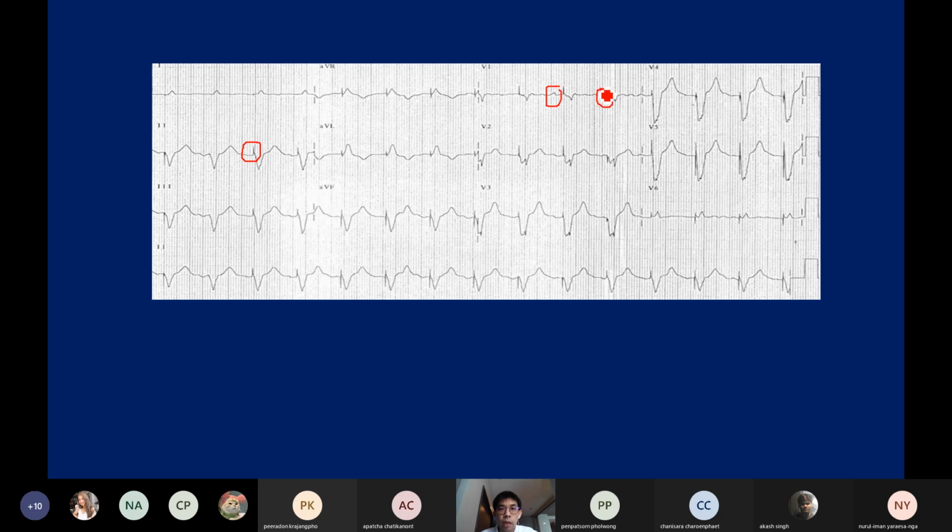There is no spike, but from this ECG we could not tell whether there is an atrial lead or not, because even if there is, we could not know if the atrial lead is sensing from this P wave or not.